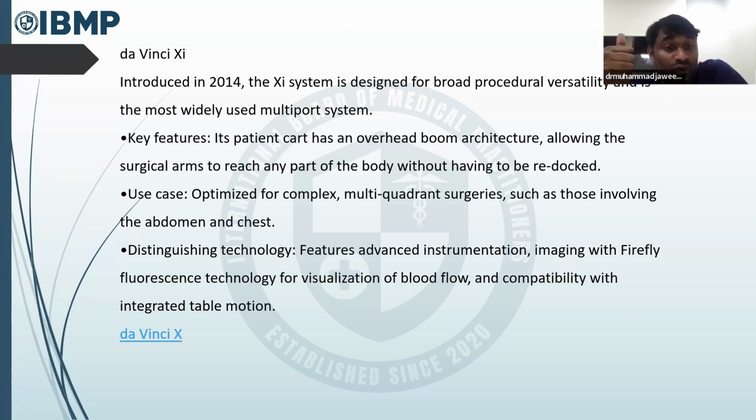Firefly fluorescence technology is nothing but, suppose you have any doubt about tumors, either benign or cancer, you can ask your assistant to start fluorescence technology. The patient cart has its own arm for visualization of blood flow and compatibility with integrated table motion. Got it? Point. This is the importance.